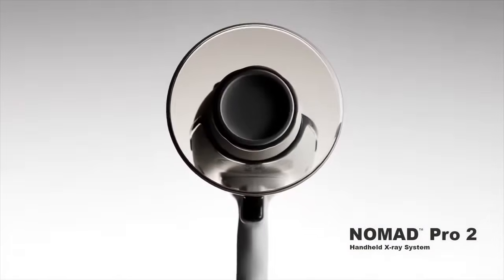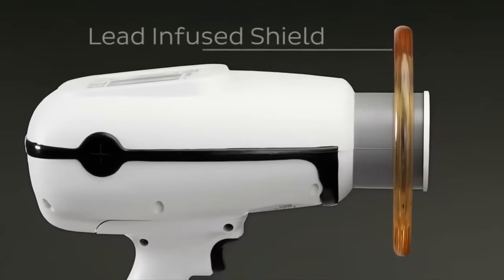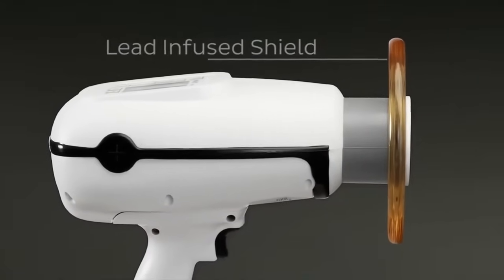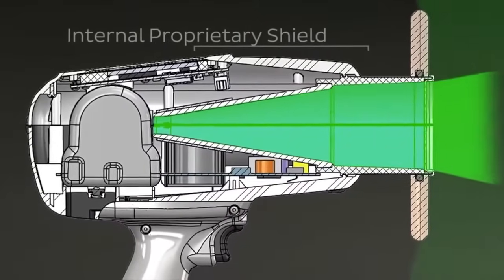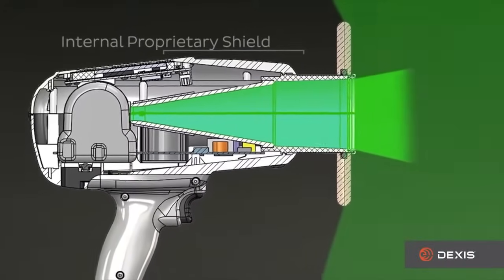The Nomad Pro 2 is safe to use for both the patient and the clinician. The Nomad has two highly devised shielding features. A unique lead-infused acrylic shield protects the operator from direct and scatter radiation, while an internal proprietary housing encases the x-ray tube to block radiation leakage.